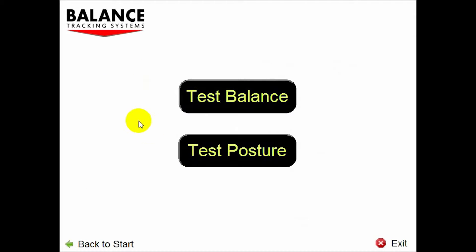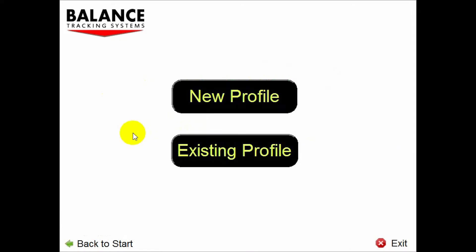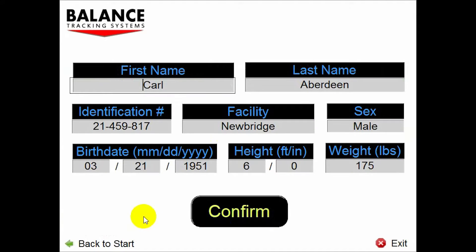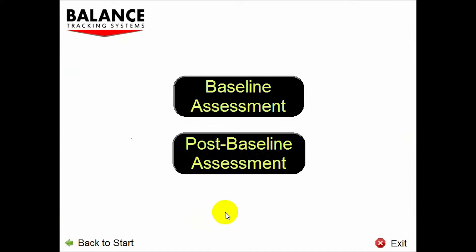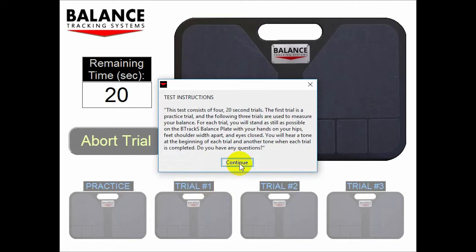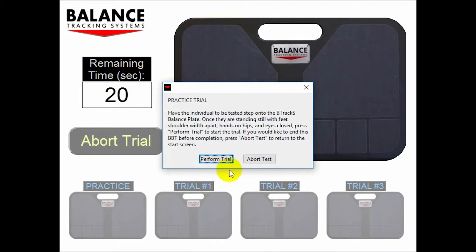First of all, choose Test Balance. Then choose Existing Profile. We choose Carl Aberdeen, then confirm the profile. Then choose Baseline or Post Baseline. We'll choose Post Baseline to show how the system tracks results over time.